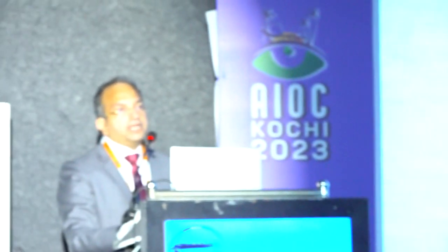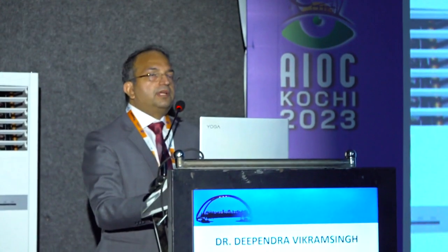You had a question. So if you're a right-handed surgeon, how do you dissect your left eye nasal TRDs and membranes? I think most of us are now ambidextrous, and I encourage fellows, especially in VR surgery, we do ILM peelings also with the left hand and all the dissections. You can be slower than when you are doing it with your dominant hand, but this is something one has to practice. Otherwise, you can still do it, but the safety gets better if you are able to shift hands.